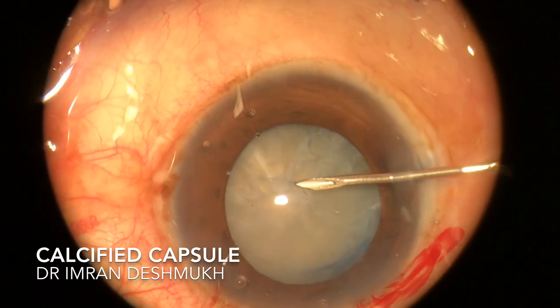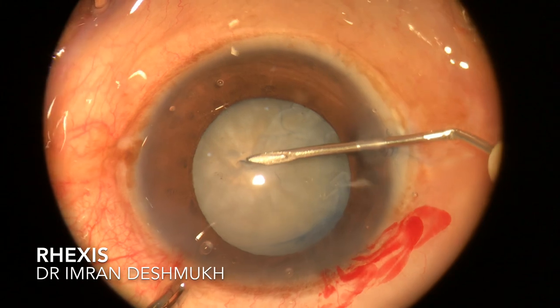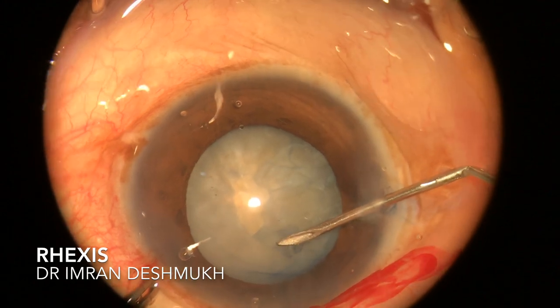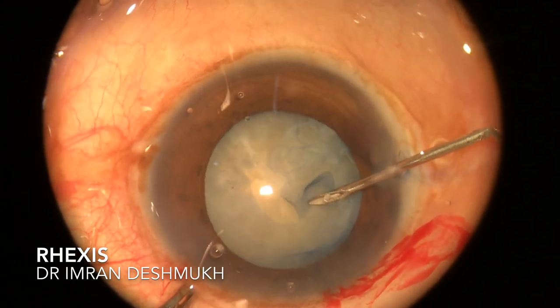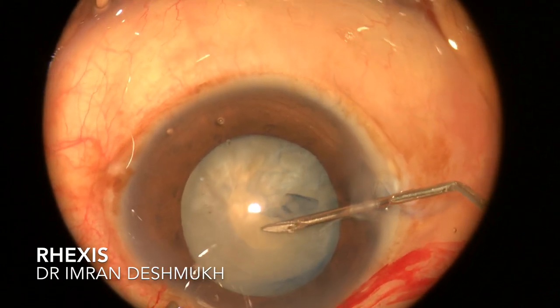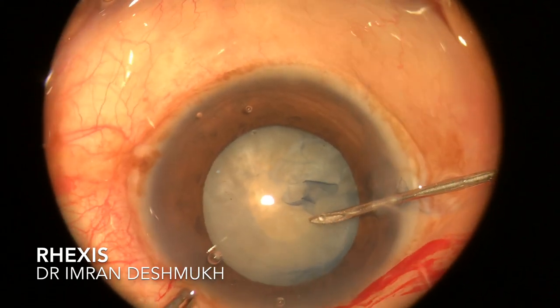I couldn't find any place where I could make a rhexis, but luckily I found one part where the capsule was not calcified. I slowly took that part and started making my rhexis. Though the rhexis size was a bit small, you can extend it anytime.